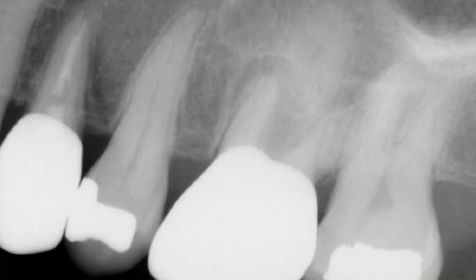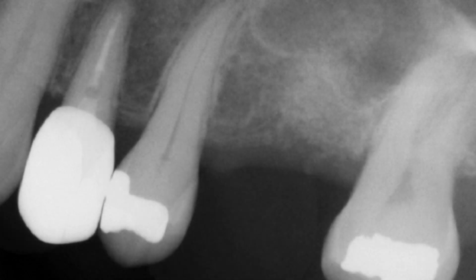Like in every general dentistry practice, I also place implants in my office. When I compare my complex cases, which I call my overdenture cases, maybe 4 implants and an overdenture, or my hybrid cases, to my simple cases, my simple cases are my single tooth replacement using dental implants.